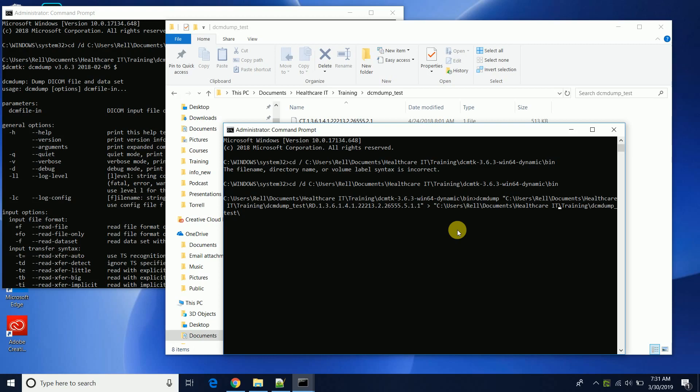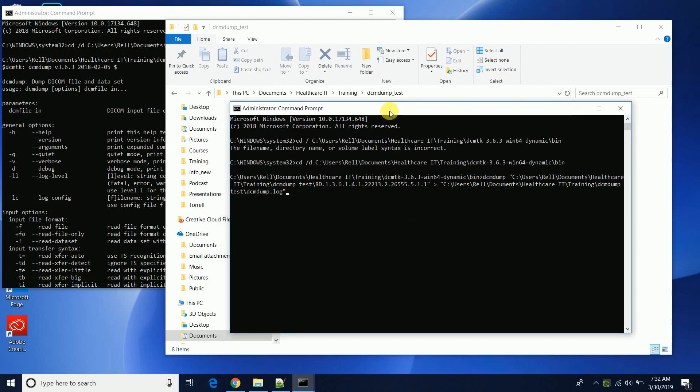Alright, and we want to send it to the log file here. Okay, so we have our input file, we're going to output it to this log file here and that should be it. So we go.